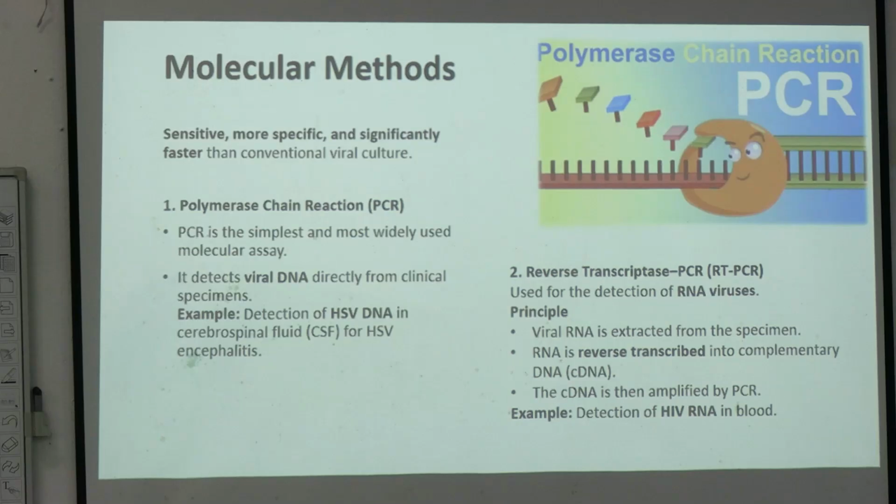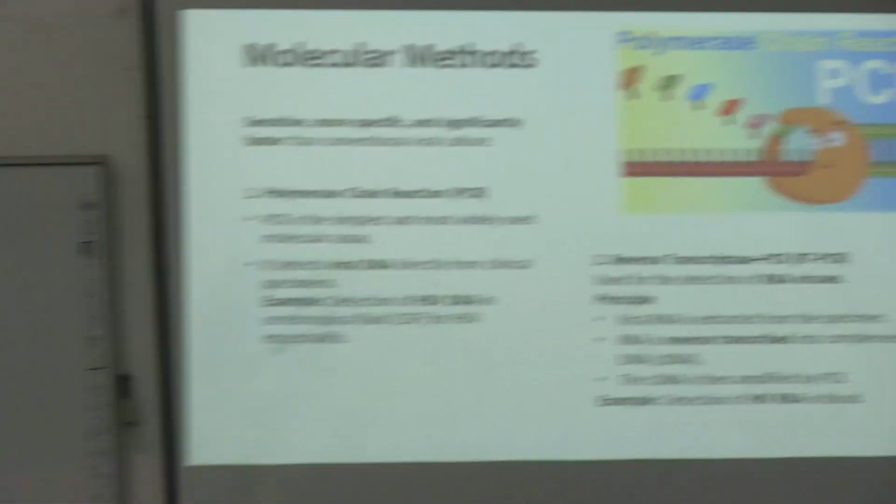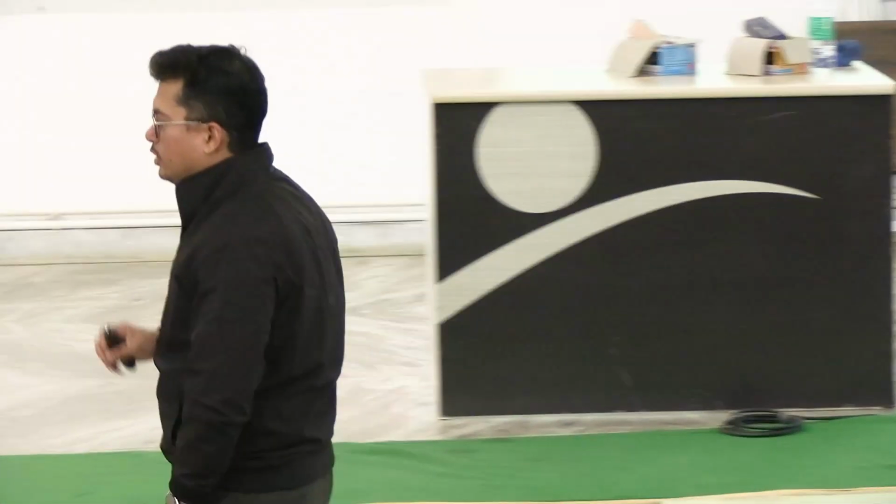Next is the molecular method, which is everybody knows this molecular test, I think from the COVID period. I mean, the general population also know what is called a RT-PCR. RT-PCR মানে তুমি জানতে 5 বছর আগে জানতে না। Reverse transcriptase polymerase chain reaction. Don't confuse RT-PCR as the real-time PCR. Real-time PCR কিন্তু RT-PCR নয়, ঠিক আছে? RT মানে হচ্ছে reverse transcriptase.